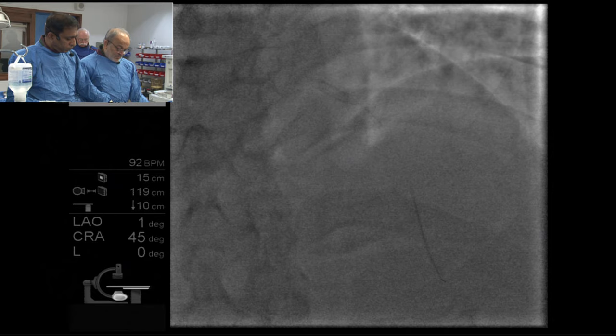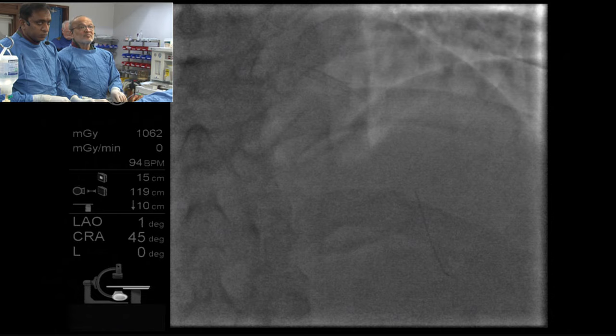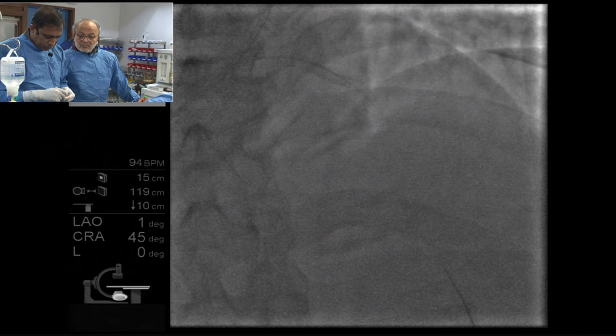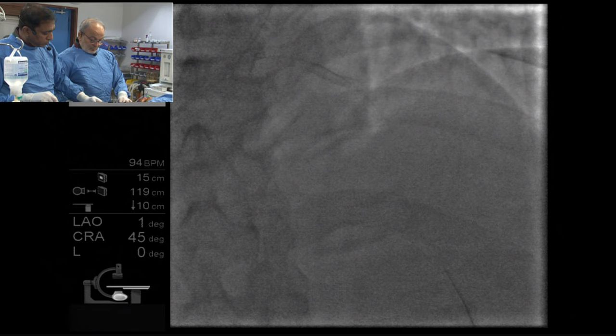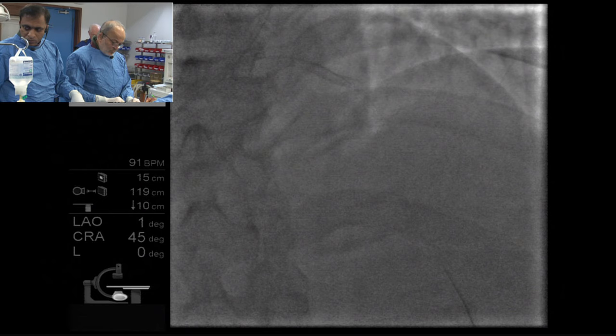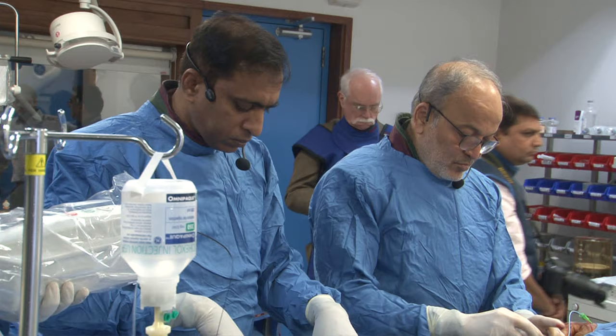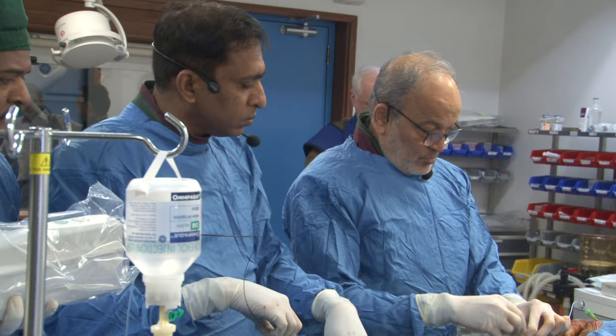Restenosis. Yeah, not thrombotic, so I would say no, but there is some data, at least in the bare metal stent data and even in the drug-eluting data, that addition of cilostazol might prevent restenosis. Yeah, there is. I think drug-eluting stent restenosis is going to continue to plague us for years to come. We used to think that we'd fix restenosis with these DES, but some people just get DES restenosis, and it's a real challenge, particularly the ones who go to surgery and the grafts fail. I think everybody has a handful of patients who they've tried everything with, and I think there's a market for a durable solution for this. We haven't figured out what it is, though.